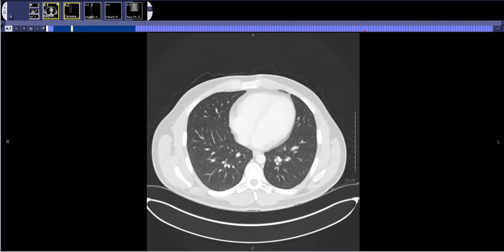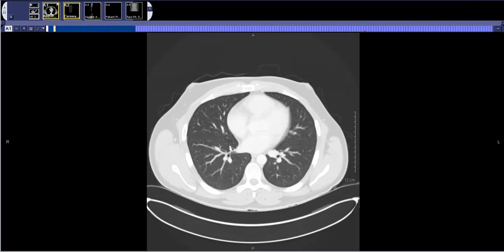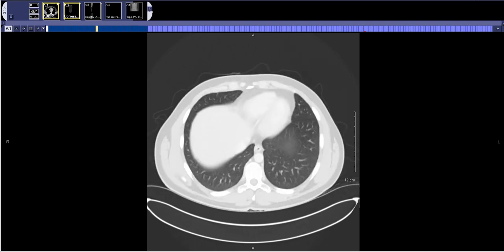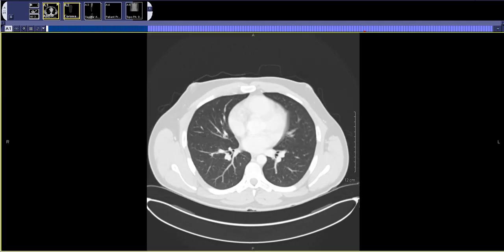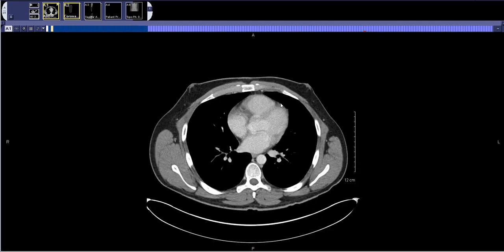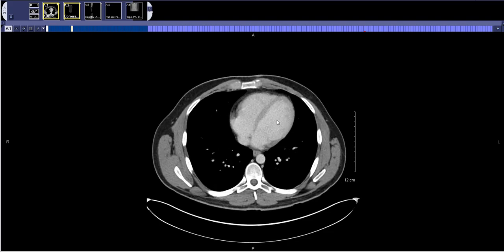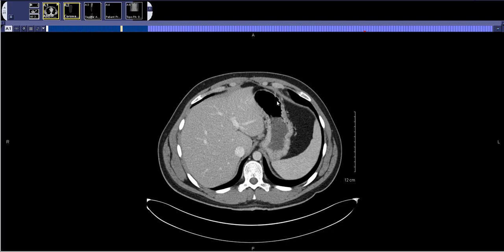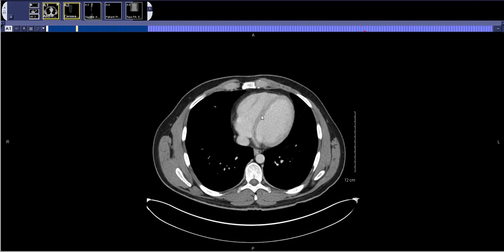So up and down four times, just looking for any nodules, masses, or consolidations in the lung bases. Then I look at the heart — scroll down, make sure I don't miss anything big in the heart — and then I'm done with the lung bases.